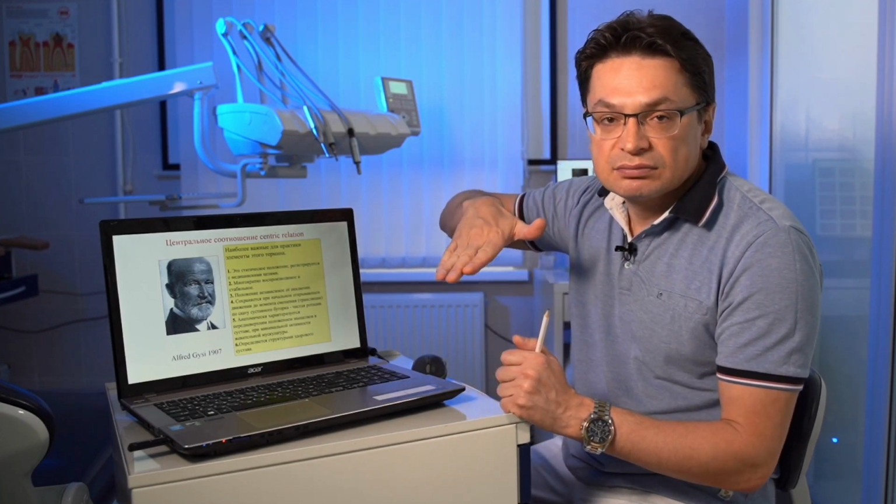Third moment. When registering, it remains within 15 to 20 millimeters during opening. This is the initial opening. The fact is that there is a temporomandibular ligament that stretches and the jaw moves forward. Therefore, wide opening of the mouth leads to the front jaw position. A very relevant moment in determining central relation.